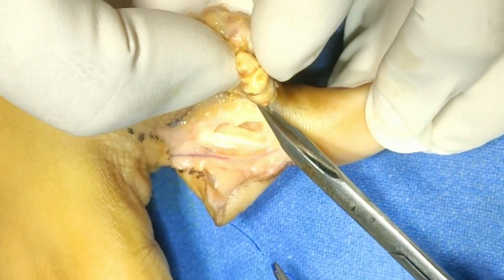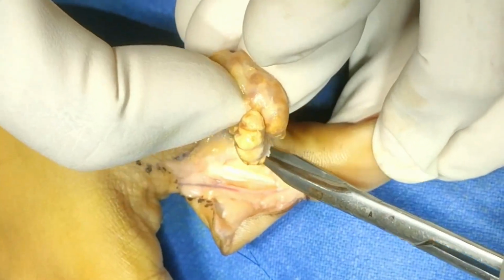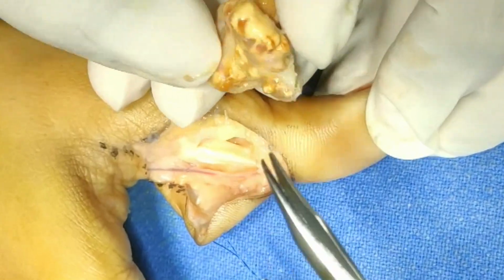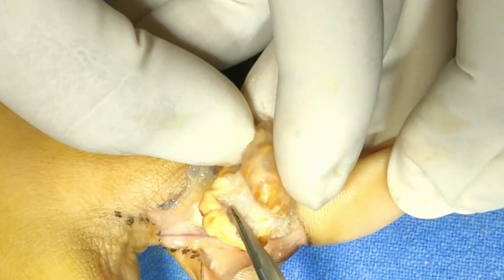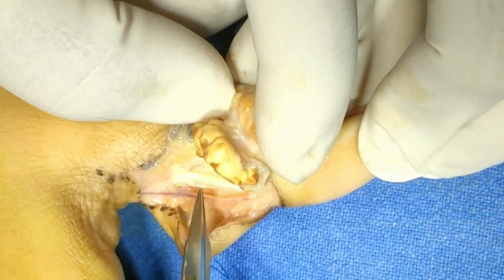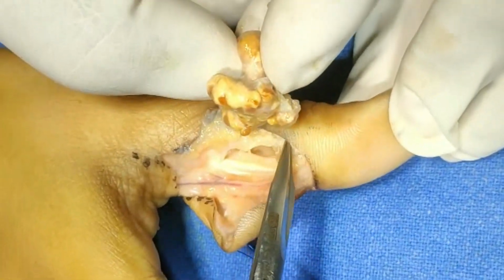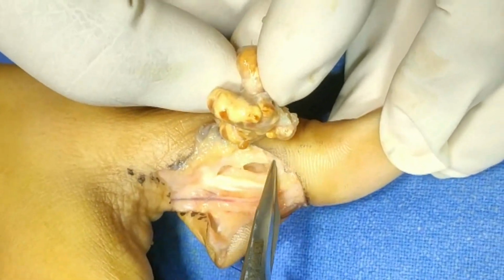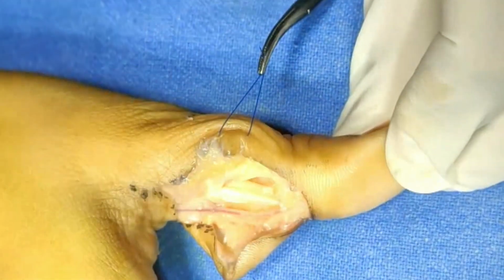Now this tumor I have removed. This part was deep to the tendon. See, this part was quite deep to the flexor tendon. You can see this piece, and there is some resorption of the bone also. This is the capsule of this joint, and it is adherent to this capsule also. So we have removed it in toto.